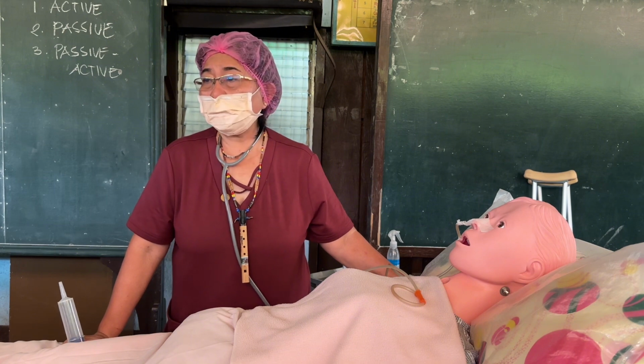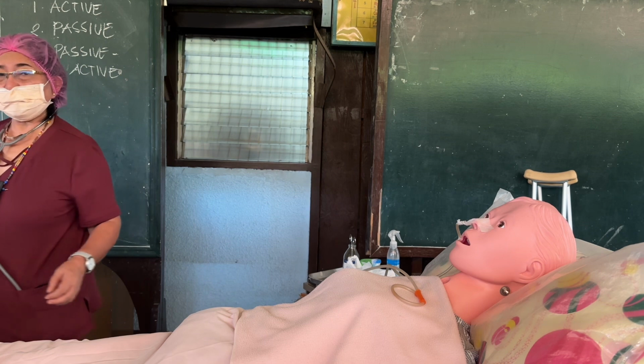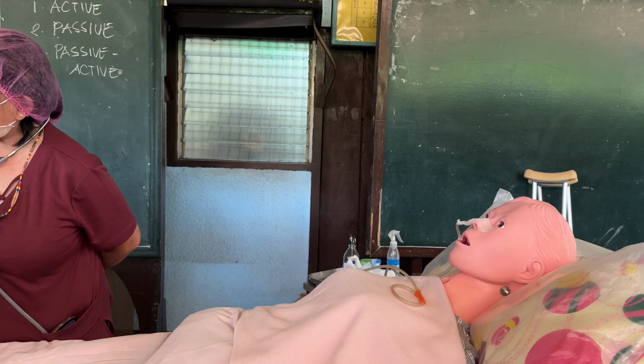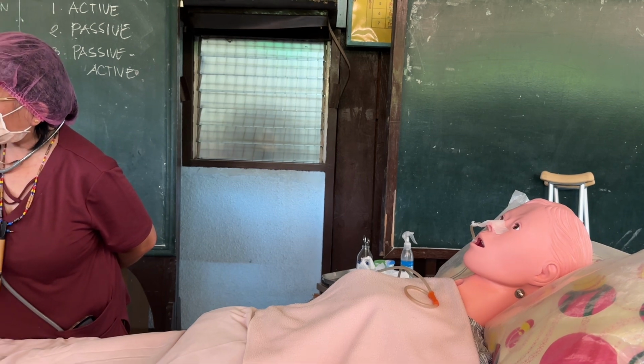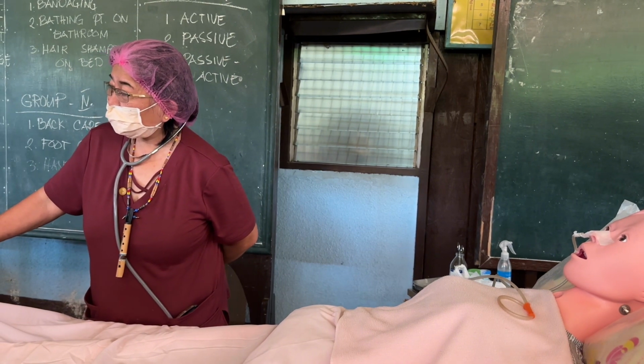Come on. What's my order from the doctor? Until return flow is clear. Until return flow is clear.